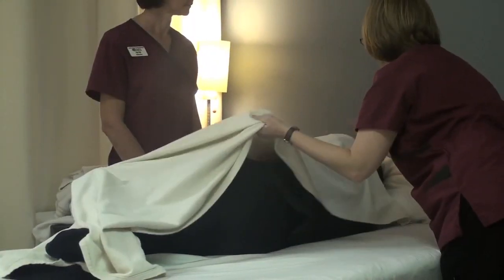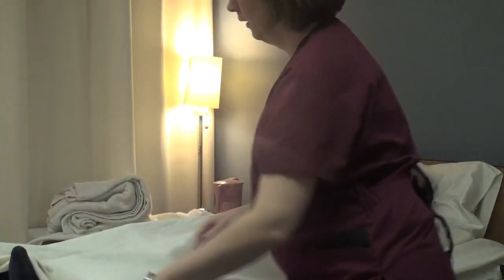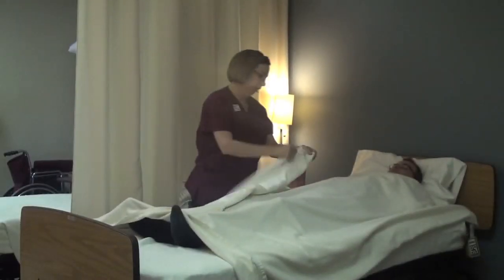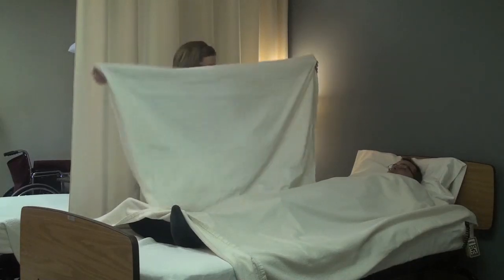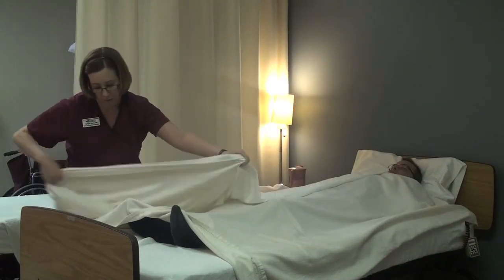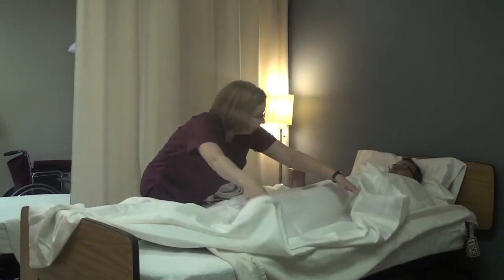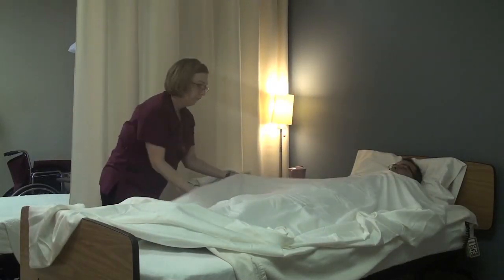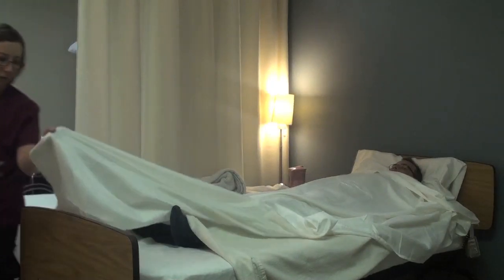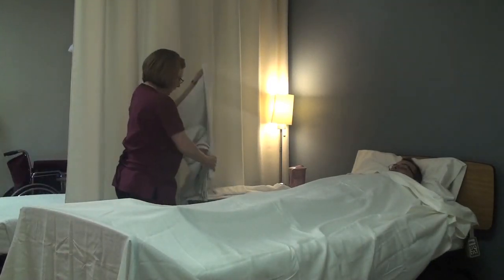Tim, you can go ahead and roll back. Thank you so much, observer. I'll go ahead and get the top sheet on — I'm just going to lay it on the bed and unfold it. I don't want to fluff my sheets and spread any germs. Make sure there's enough for your shoulders. Go ahead and put the blanket on too.